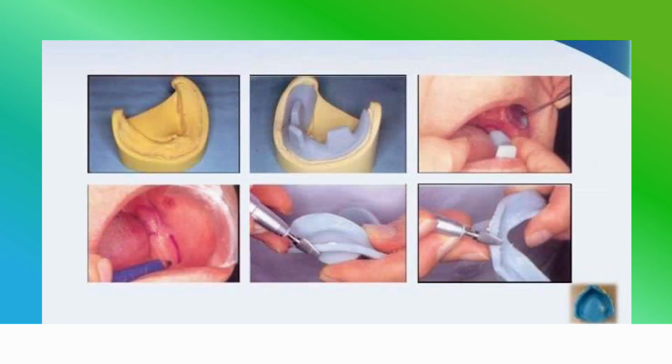In the same fashion it is done for the mandibular arch. Please ensure that the extensions are 2 mm short of the sulcus on all the sides: labial, buccal and lingual.